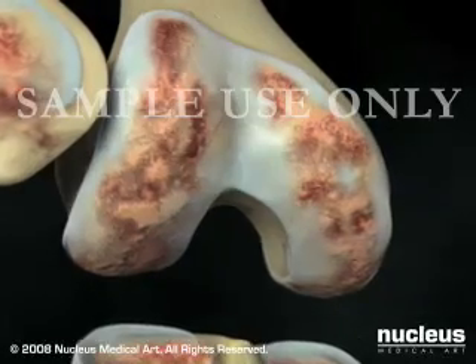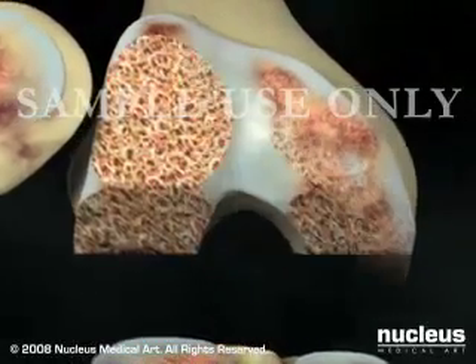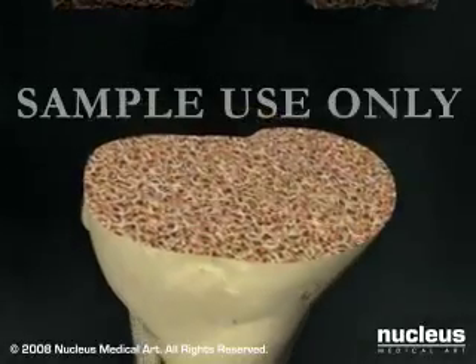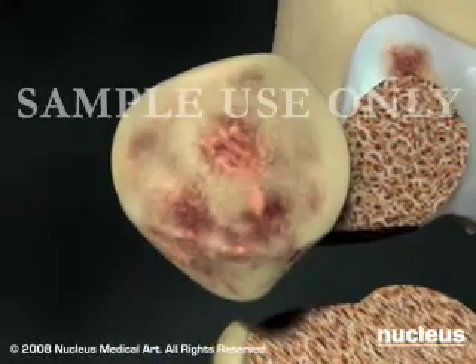Using specialized tools, your surgeon will remove the damaged bone and cartilage on the ends of the femur and the tibia, and in most cases, remove the underside of the patella.